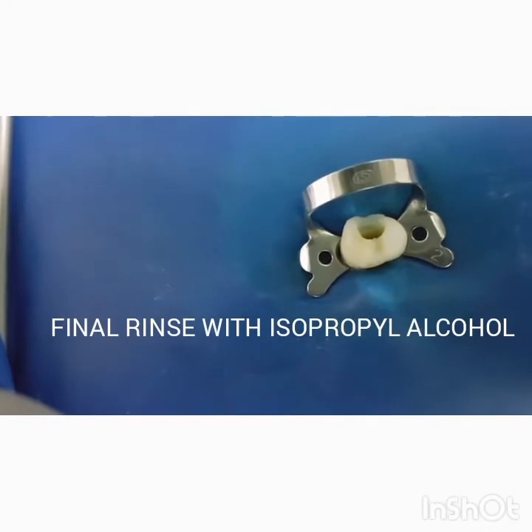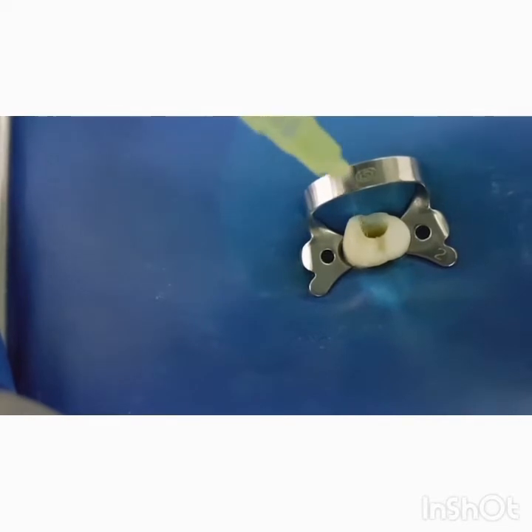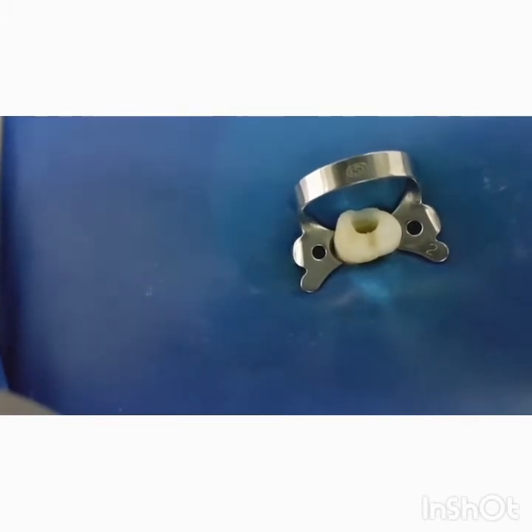At this point, a final rinse with isopropyl alcohol is highly recommended due to its high evaporation rate. This reduces the paper point usage. Subsequently, you will aspirate or apply back pressure with the same syringe to ensure elimination of the major amount of moisture.